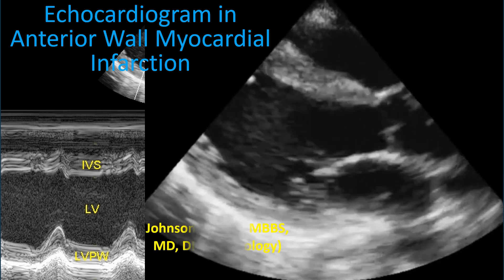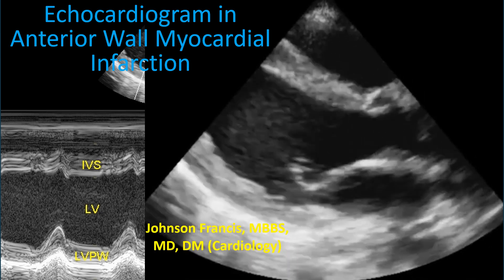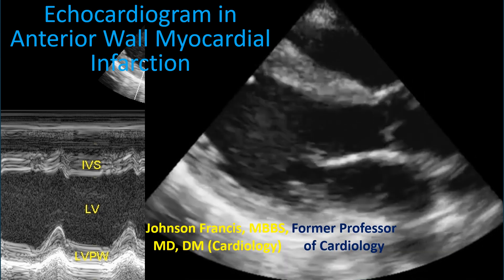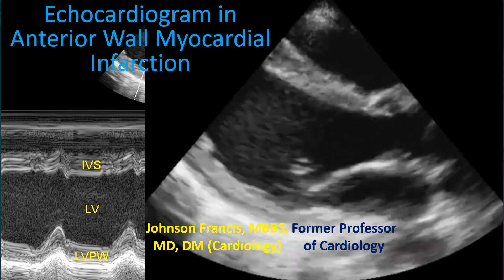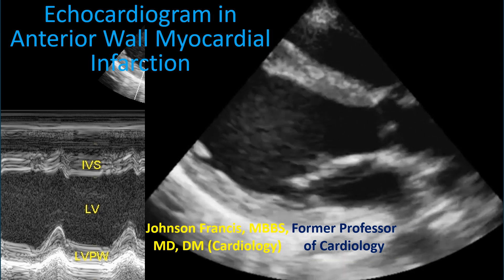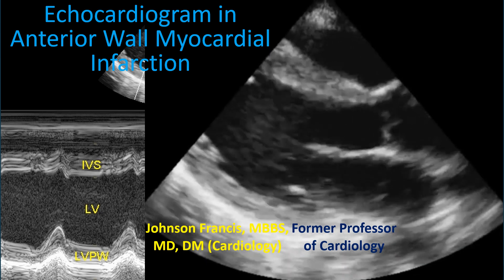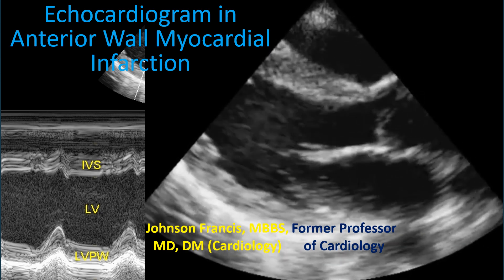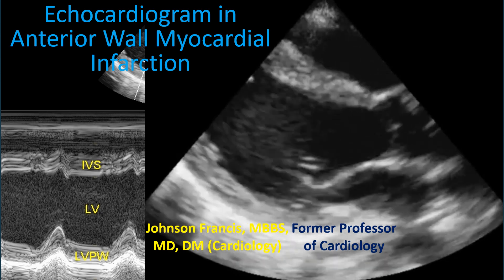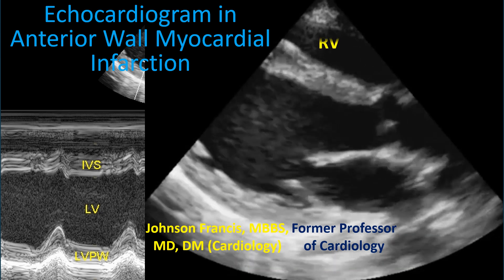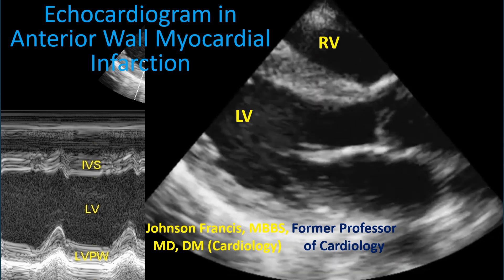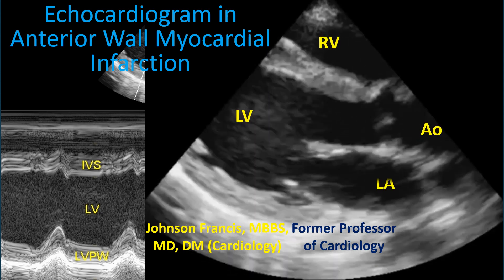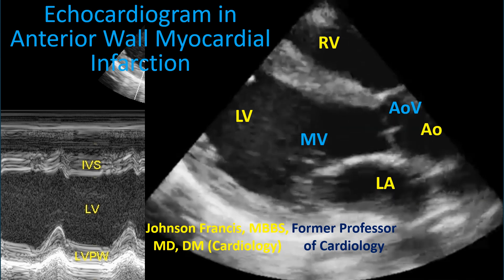Echocardiogram in anteroseptal myocardial infarction. The left panel shows M-mode echocardiogram while the right panel shows 2-dimensional echocardiogram in the parasternal long axis view, showing right and left ventricles, aorta, left atrium, and aortic and mitral valves.